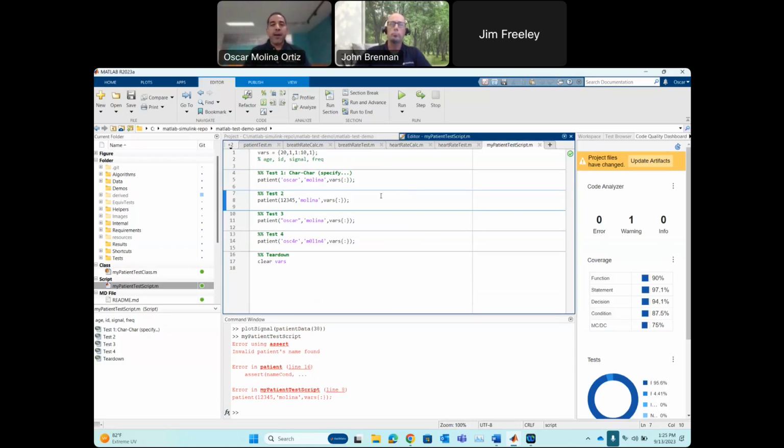Let me tell you one. Notice that the script stopped at this point. We didn't get to test these 2, so we didn't get to the end of the test. And second, we didn't get to clear up our memory. So there's a bunch of data still in memory that we need to take care of.